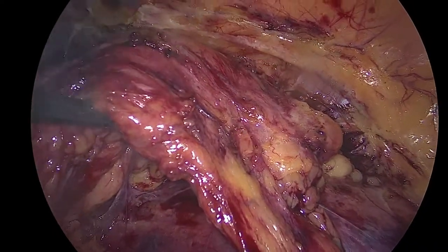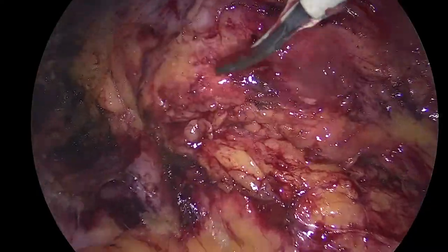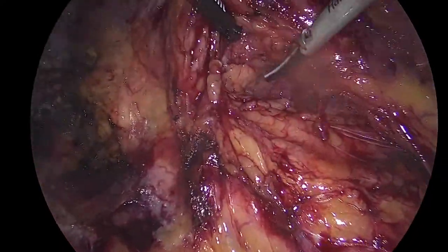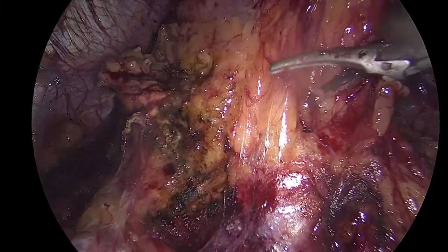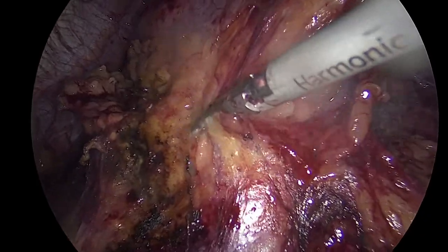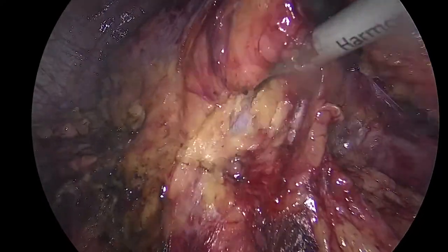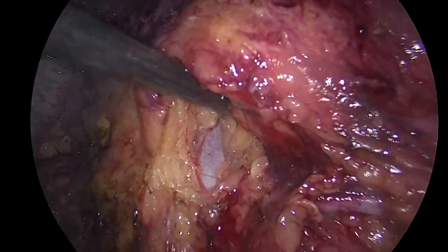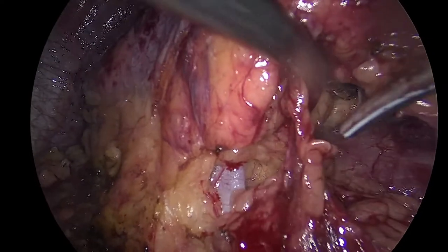Harmonic. I will need someone. We will need an extra assistant. Eh? Yeah. Go back. Show me here. Good. So this is adrenal here. Show me here. This is the ureter here. So we start dissecting on the hilum. We want to find the hilum, eh? I always keep the light on in the room because I want the nurses and everyone to be able to see what they are doing. So here's the vein. See that? Nice. Good. So here's the ureter. Ureter, nicely. Here is probably the gonadal vein, okay?